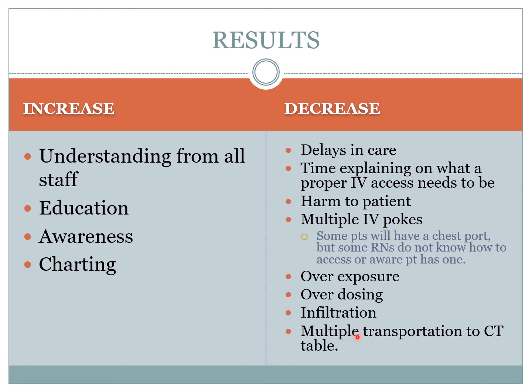And speaking of elderly, imagine having to go back and forth from the room to the scanner, from the room to the scanner, because there's an infiltration or a bad IV or the wrong IV when they show up to the room or not. Or when we have a broken bone and you have to be moved so many times. It's no fun. We don't want that. Our priority is our patient.